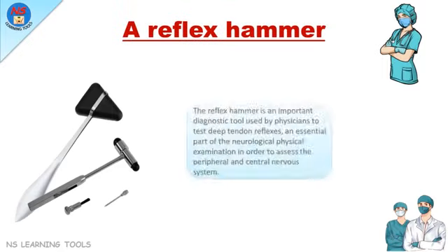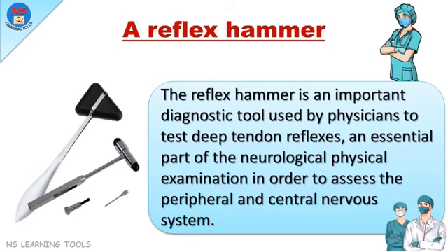A reflex hammer. The reflex hammer is an important diagnostic tool used by physicians to test deep tendon reflexes, an essential part of the neurological physical examination in order to assess the peripheral and central nervous system.